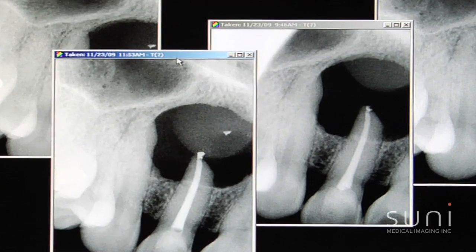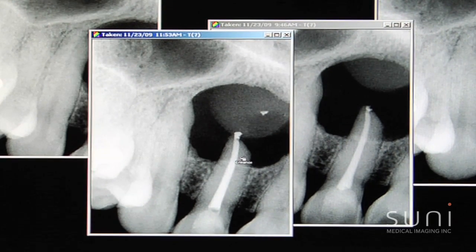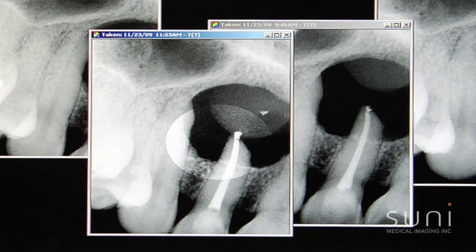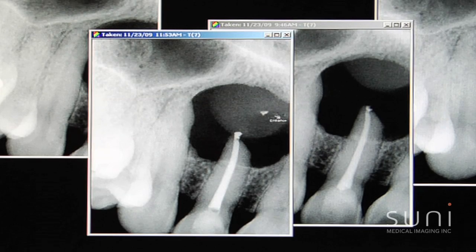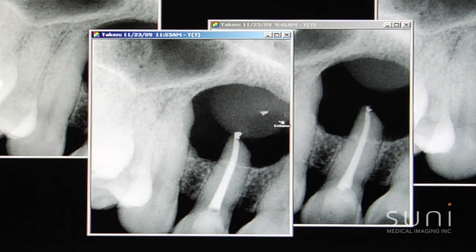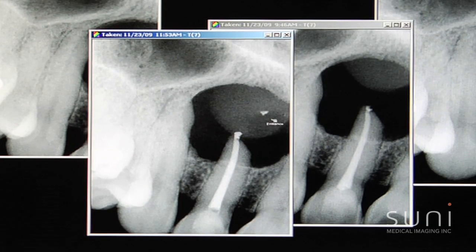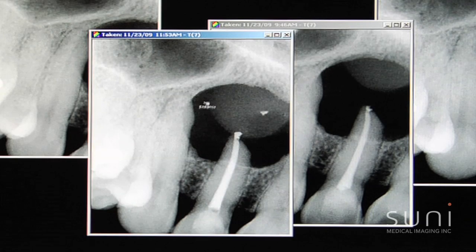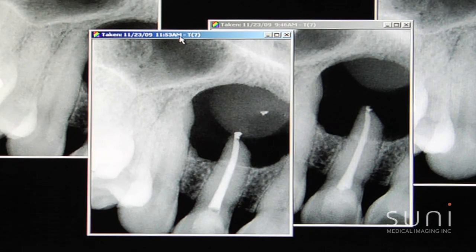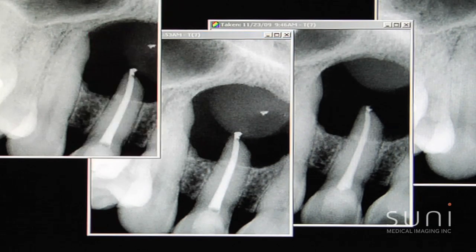So we retreated the case — here is before and this is after — and we know that this is not going to heal. So we're going to have to intervene surgically. The young lady is slated to undergo apicoectomy and we're going to send this tissue in for biopsy to confirm our differential diagnosis: cyst, granuloma, or whatnot.